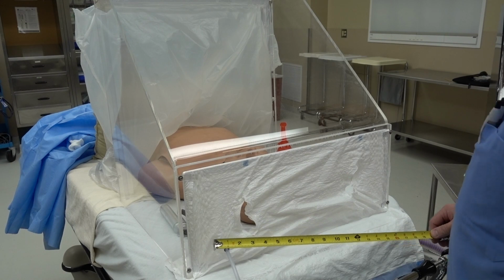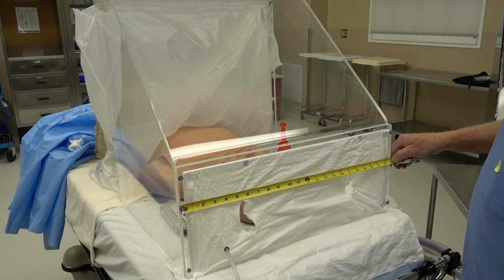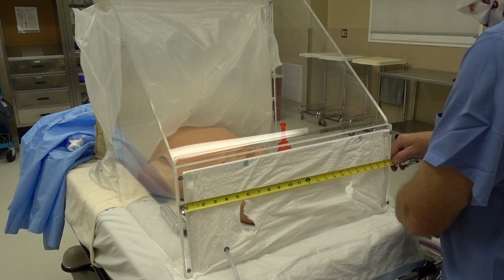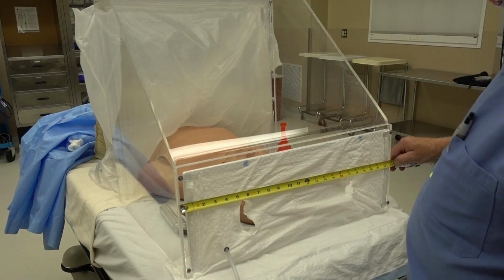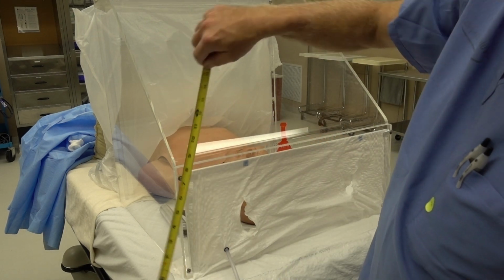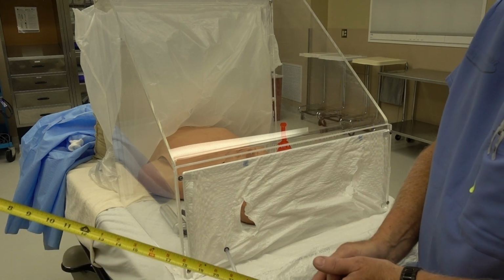The dimensions on this containment, aerosol containment equipment, this is approximately 23 inches wide. Your bed will have to be 23 inches or a little over because you want this to seal all the way around. Some of our OR beds are much narrower than this, and you just remove the top cushion, have a plate or a board made, whatever you need. To get 23 or 24 inches, I'd say at least 24 inches, and you can use it on any bed if you do that. So again, we've got 23, it's about 10 inches high to there. Our viewing board is about 20 inches, and our depth is about 20 inches.